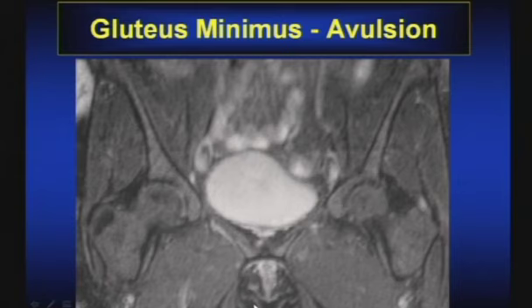In many cases, these patients are presenting with a very vague history, just hip pain. So they'll end up getting a screening hip series, which may be wide field of view, 40 centimeters, including both of the articulations. In these cases, sometimes it's really challenging to have enough resolution to really make specific diagnoses, but we can do it.